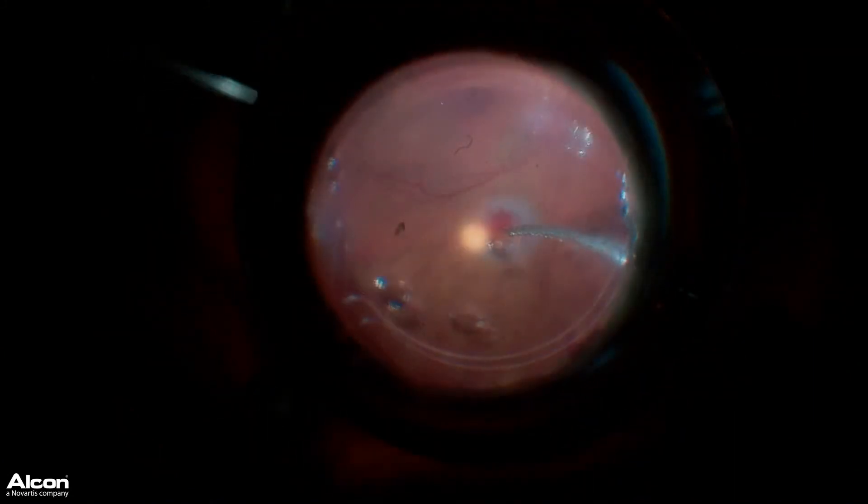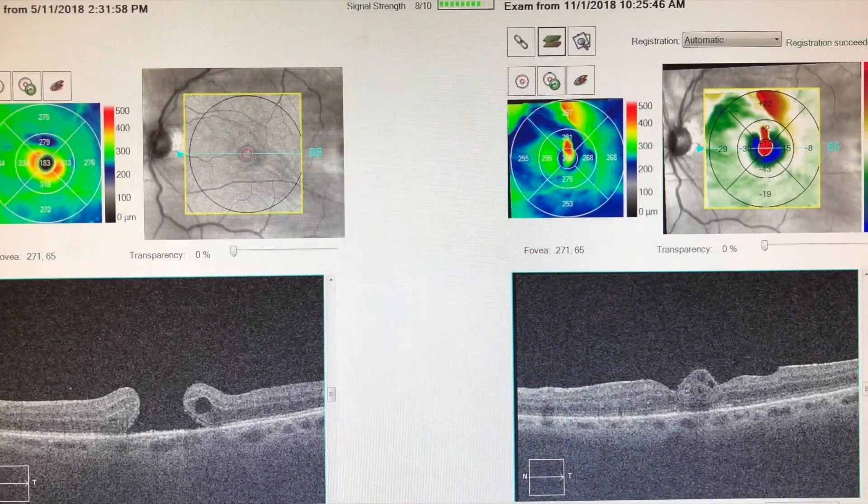I then laser demarcate the harvest site and leave the PFO in for several days before going back and removing the PFO. The patient has done fairly well with modest recovery of vision.